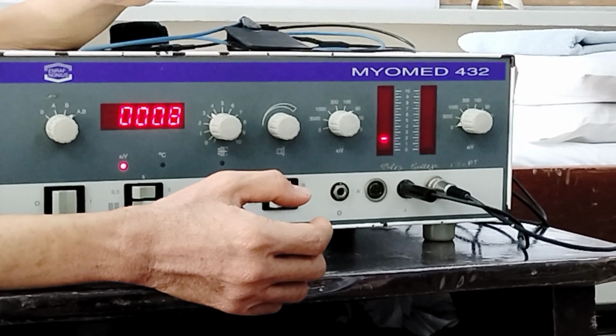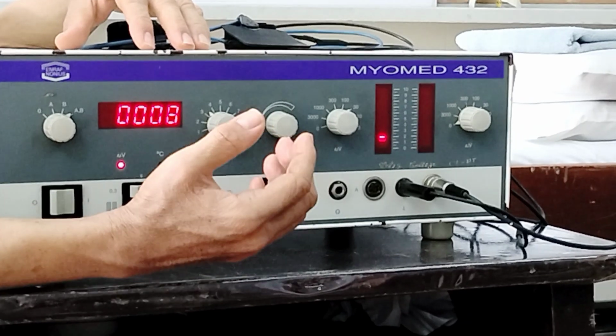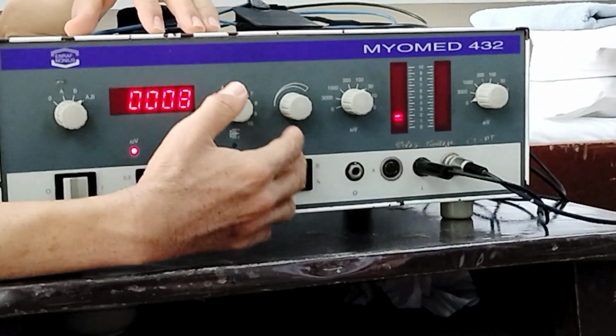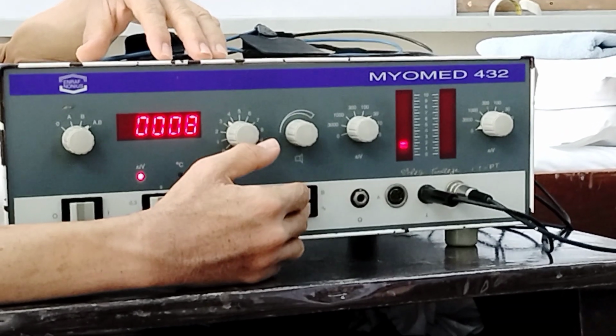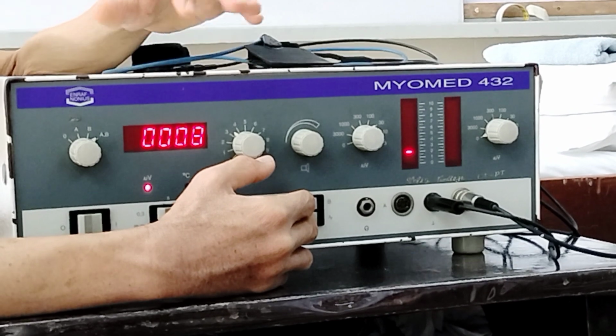And then, for muscle relaxation, so the patient will relax, you can choose a sound that the patient doesn't like to hear, like for example rock sound.